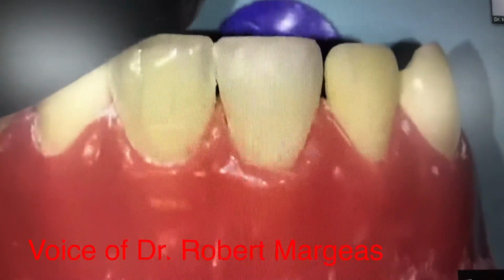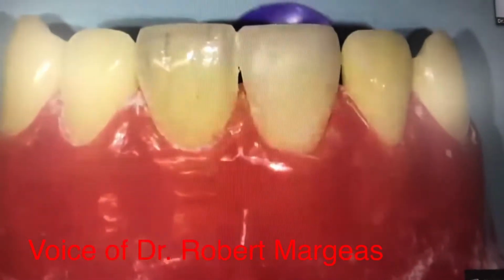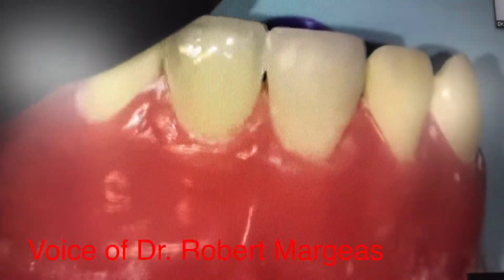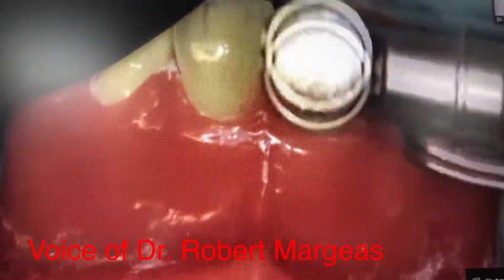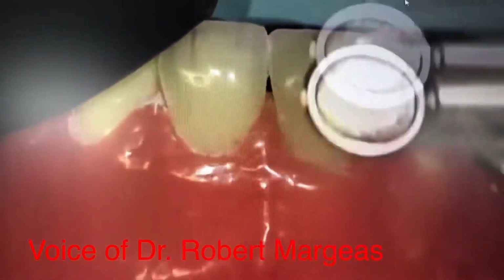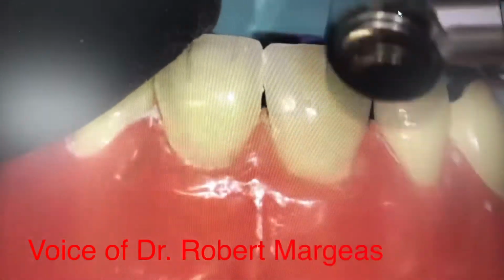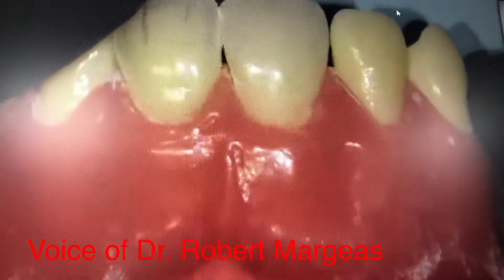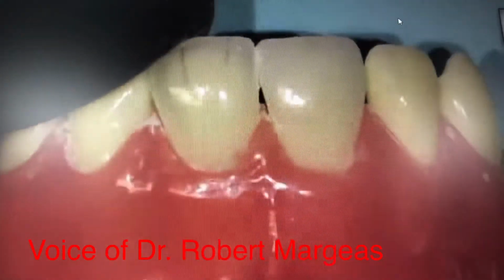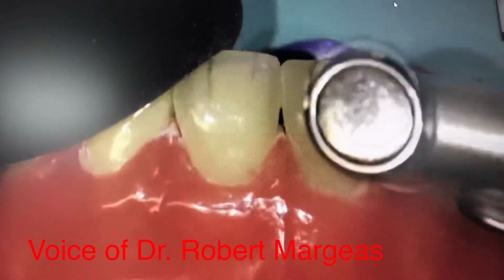Okay. You can see a little bit of the depression. And then I go to my peach one. And then I'm going to go to my final, I'm going to show you another way of doing it. So we have this. And this is the final one. They work extremely well. You can see the shine that you can get on that restoration in a matter of a few seconds.